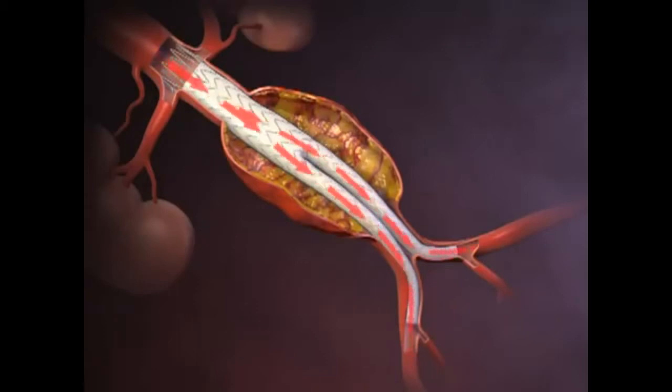Aortic blood subsequently flows through the stent graft. Endovascular abdominal aortic aneurysm repair is intended to relieve further pressure on the aneurysm and reduce the risk of further dilatation or rupture.